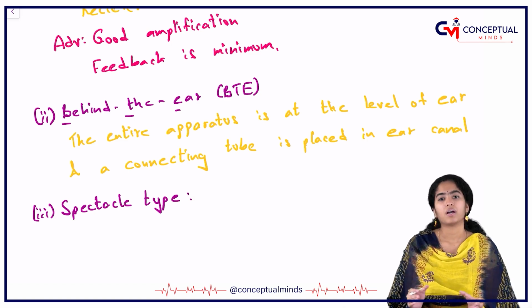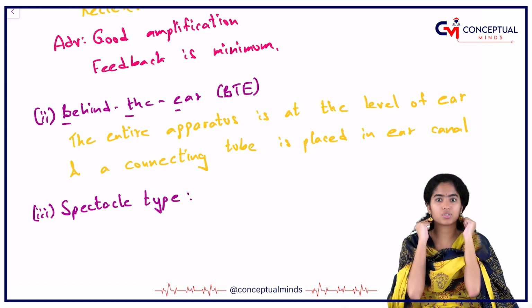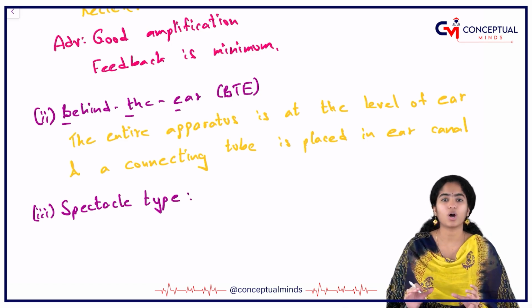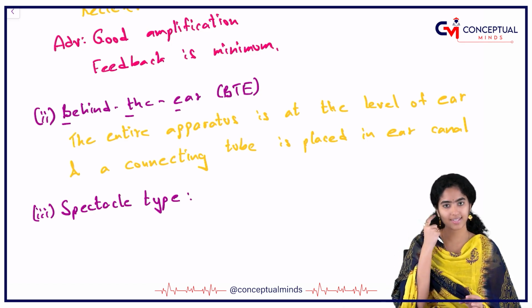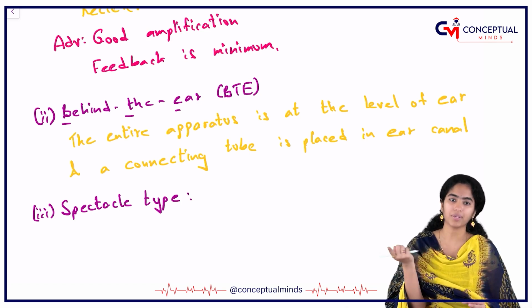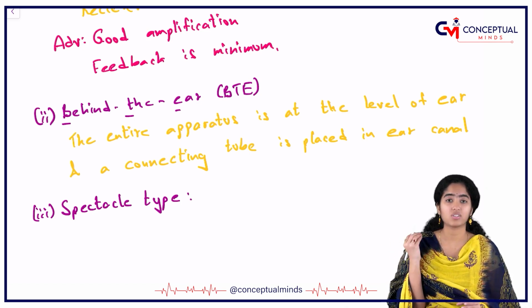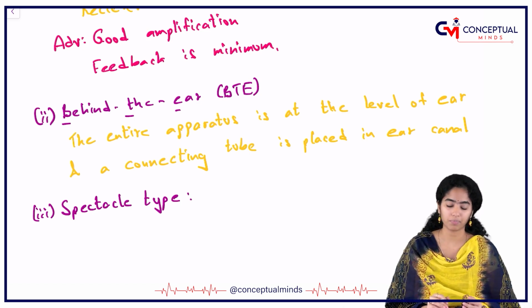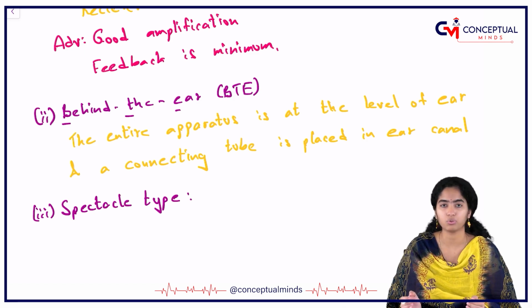What we do is, the patient will wear glasses, and glasses will have these edges, right, which are put behind the ear. In that frame, this entire auditory apparatus is put. So they can just wear glasses and that will address their vision problem plus also the hearing aid. Also, the hearing aids are not very conspicuous. All that you see is the glasses. So that was the idea behind spectacle type, but I think I can say they're almost obsolete now. Nobody uses them, okay?